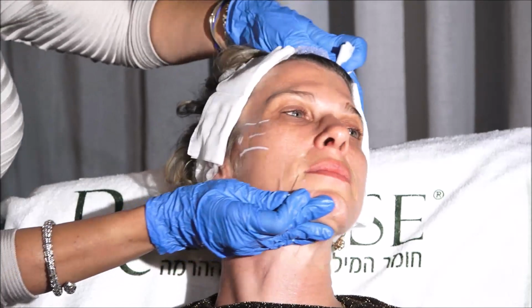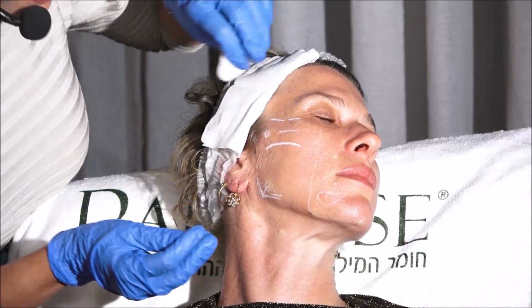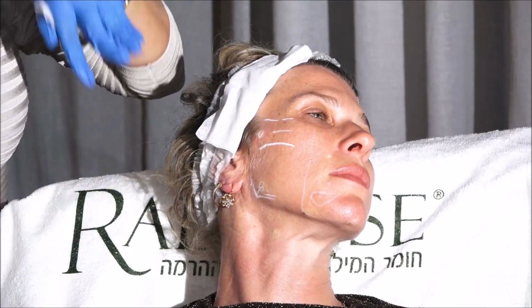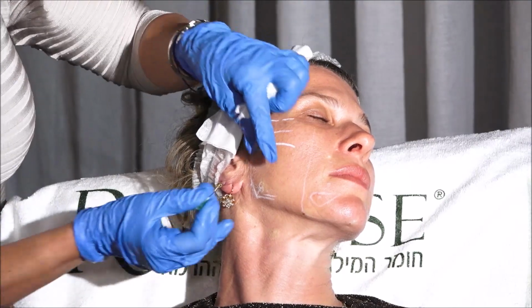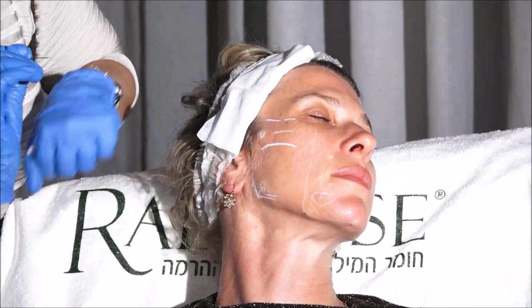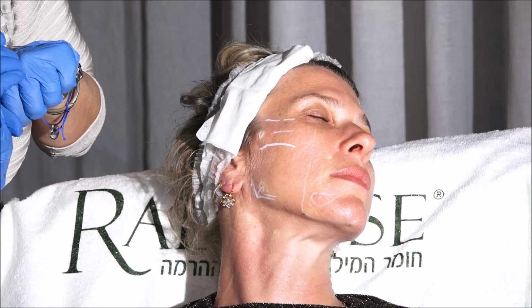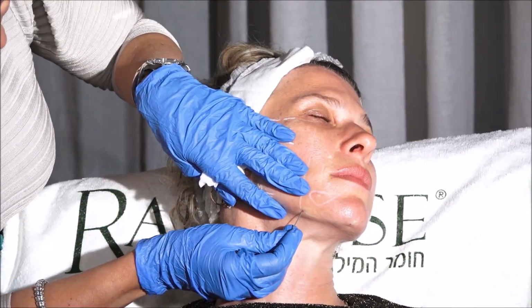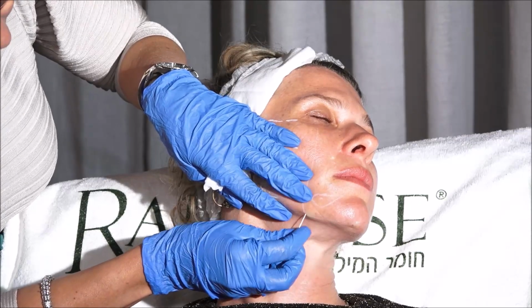So let's do it. I always start with the lateral face first, deep to superficial. So let's start with Radiesse Plus in the mandible. Let's put structure first, and then we flush with the other. So we're going to start here, and chin.